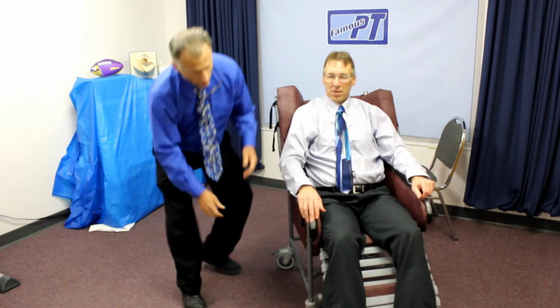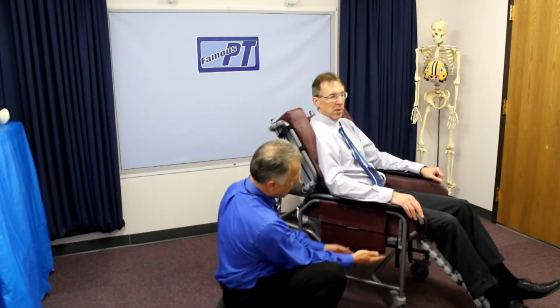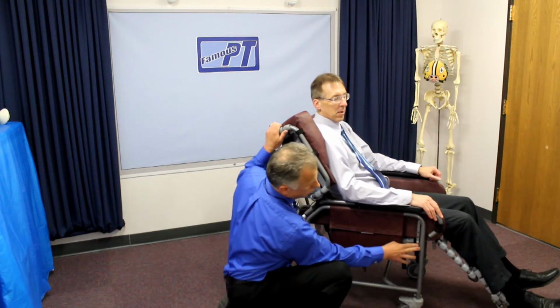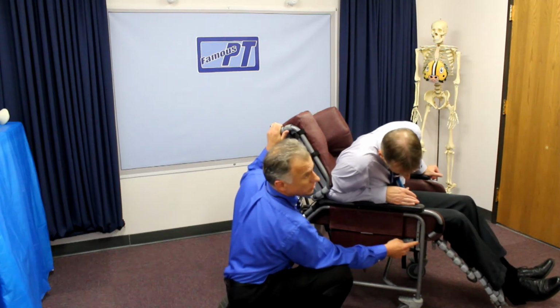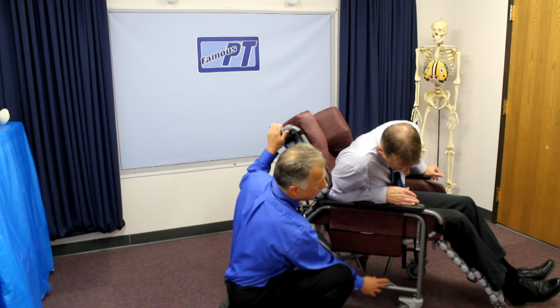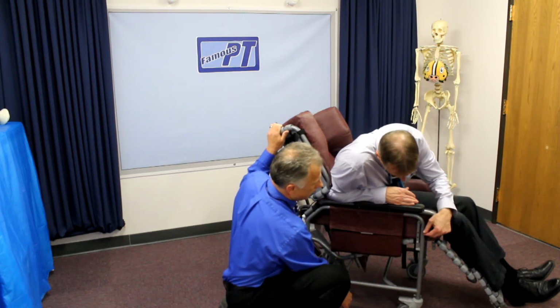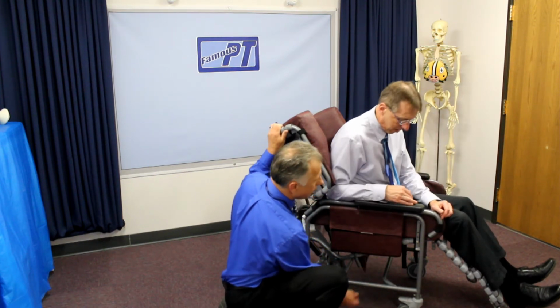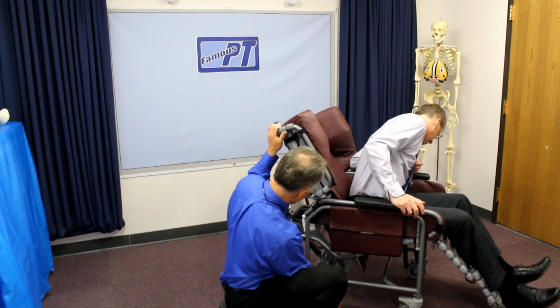Now, there are adjustments here for the seat pan. They go up and down for different height people. So Bob, we want to move it up probably. You can go two heights, or 3: low, medium, and high. You do need a wrench, 7/16 inch wrench. The person has to be off, but you can adjust the height. So that's not anything easy to do. Well, if you got a wrench and some mechanical inclination, you can do it. It's not a big deal, but it's not going to happen just with the squeeze right there. On both sides? Yep, on both sides.